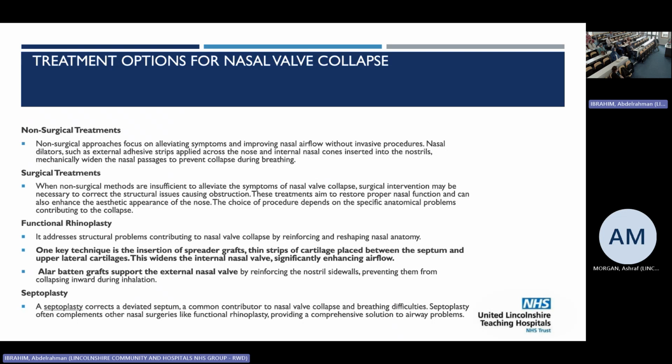There are new ones with the magnets. I find it amazing, and I use it to test the patient as well. It's not nice because you get a lot of plastic and adherent materials on your nose, so you get a lot of inflammation on the outside. The patient who uses it every day has spots on his nose, so it's not nice. Whether he needs a definite one or not, you can try it as a trial.